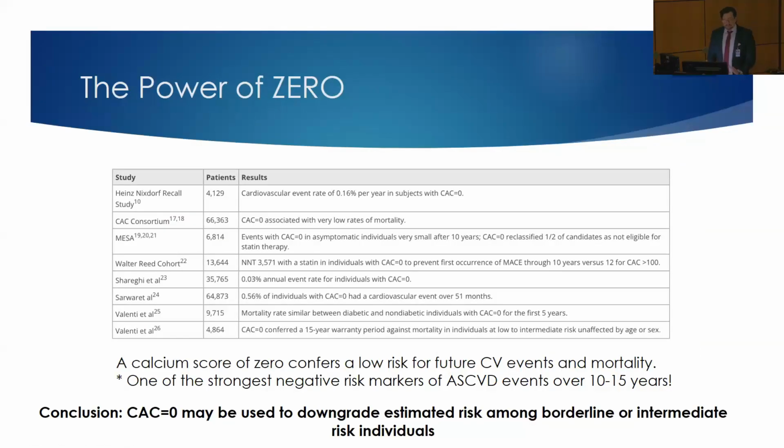And I'll say this again, because when you can get a calcium score of 0 for your patient with uncertain cardiac risk, it's a very powerful and well-established fact that they are at very low risk of having a cardiac event over the next 10 to 15 years. So I'm always thrilled when I can tell a patient that, because they're also very reassured that they're going to be fine. So it's continue a healthy lifestyle.